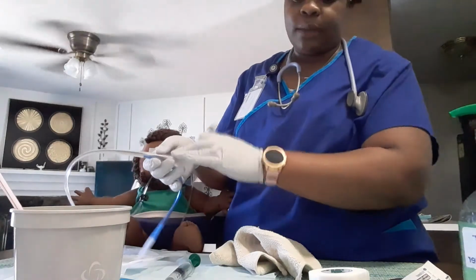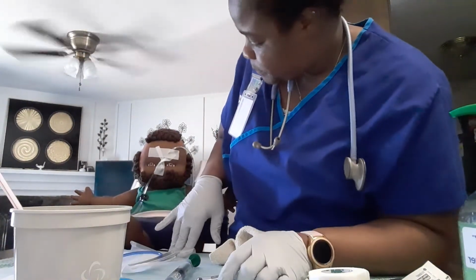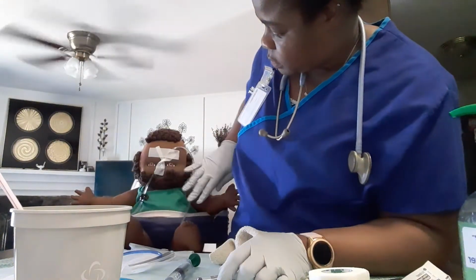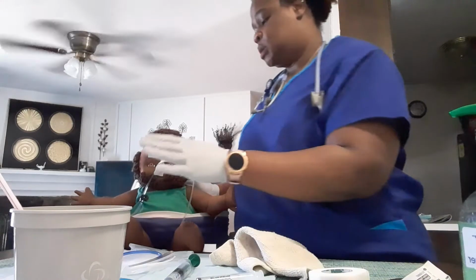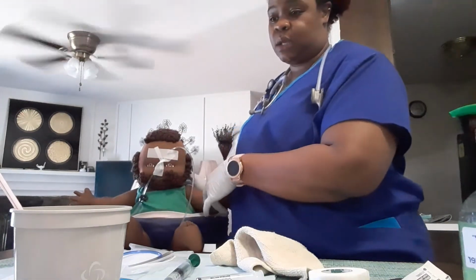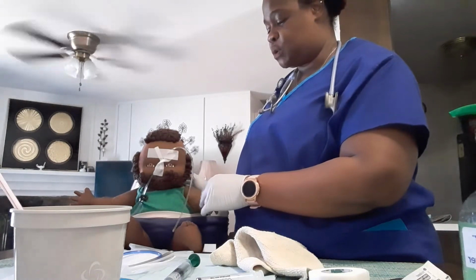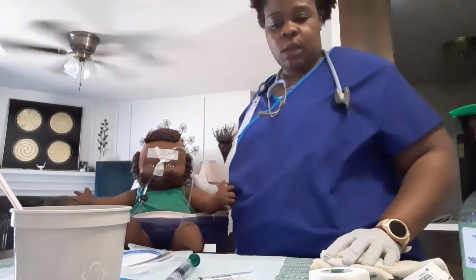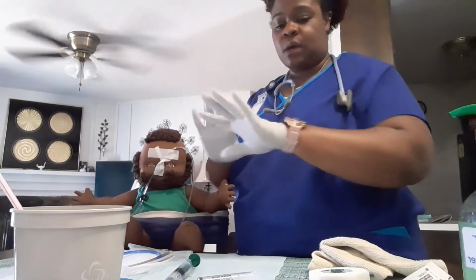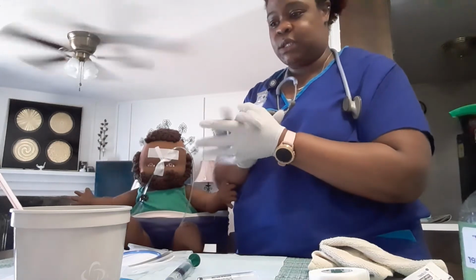And then I would clamp this tubing off, so the patient is secure. I would also want to check the lungs and check the patient's SpO2 levels, make sure their oxygen is normal. I would take my gloves off, clean up my supplies, and perform hand hygiene.